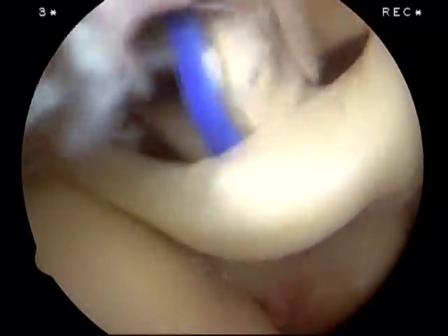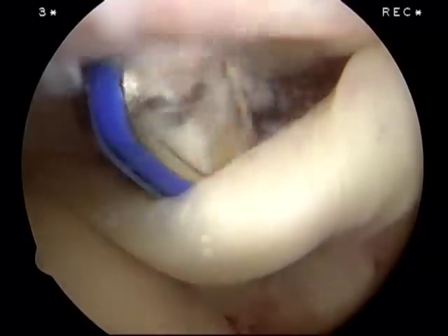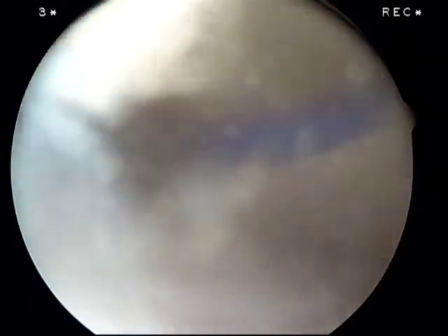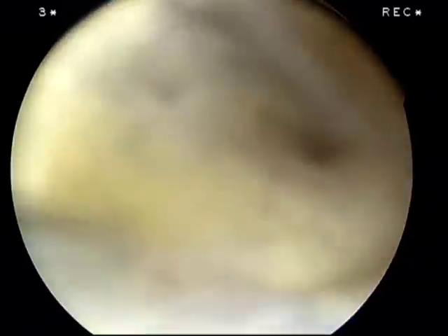I usually don't use much cautery, if any at all, on the rotator cuff, just because it's tissue we want to preserve. I start off with the shaver electroblade — the bone cutting electroblade — in the anterior portal. Once I identify the tip and can see it, wherever there's a good pocket in the bursa, I start my bursectomy. I work the camera and the shaver blade using coagulation as I shave, usually starting in oscillating mode and coagulating at the same time to get the space opened up. I keep my blades pointing towards the acromion and away from the rotator cuff.